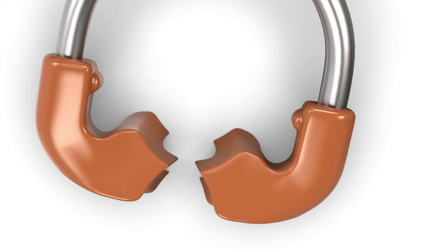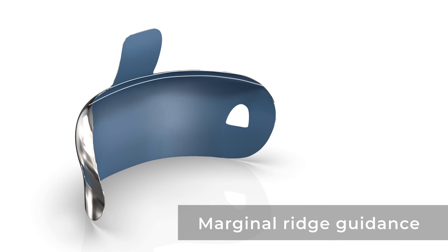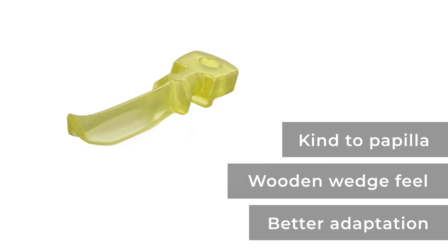I like Halo because we have good sectional matrix systems in the market, but Halo raised the bar — it makes my life easier without compromising on what we've already achieved. It is a ring that gives better adaptation, looks cleaner and stronger. It is a matrix with a little bend guiding the marginal ridge, saving time on occlusal adjustment — something that makes you feel understood. And the wedge brings back the good feeling of active wedging without compromising on adaptation or being gentle on the papilla. That's what I like about the Halo system: an easier process, a better outcome, without compromising what technology has already given us.